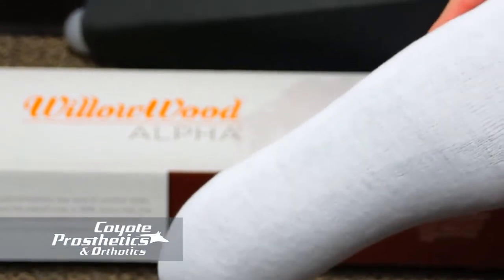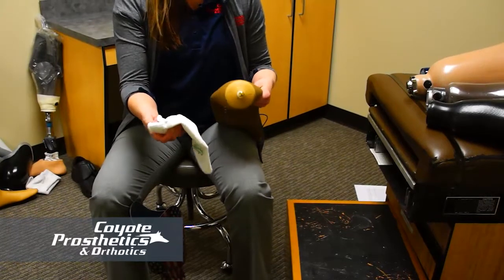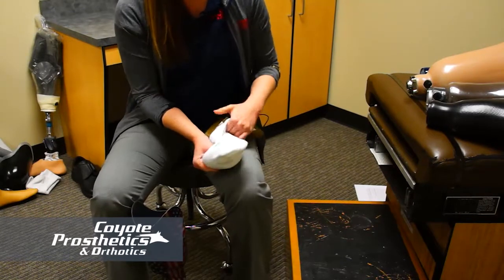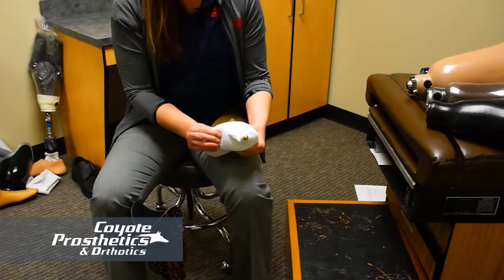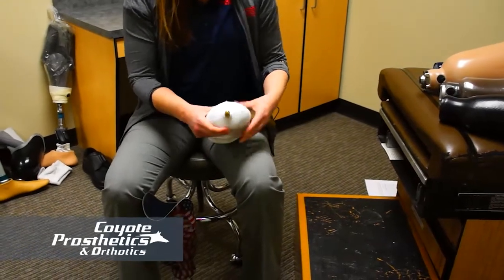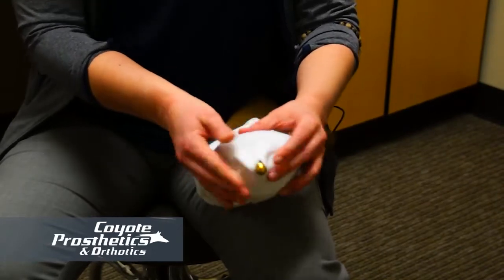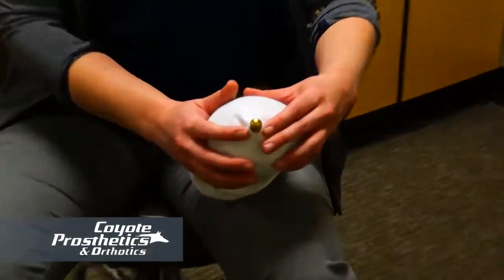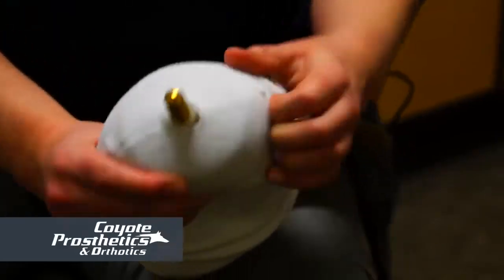So how you put these on is, if you already have your liner on, this goes over top of the liner. So we'll just put it on. This one I think has a hole in it for the pin. Yes, it does, so that is good. You just pull that on like a sock on your foot. You're going to want to make sure that the sock is right up against your liner. You don't want it to be like this, because if the sock gets stuck in your pin lock, you might have a very hard time getting your socket off, and that's no fun at all. So make sure that you have it pulled all the way up.